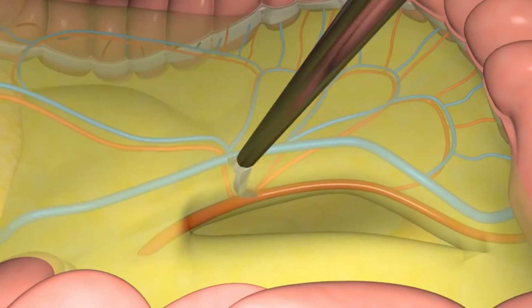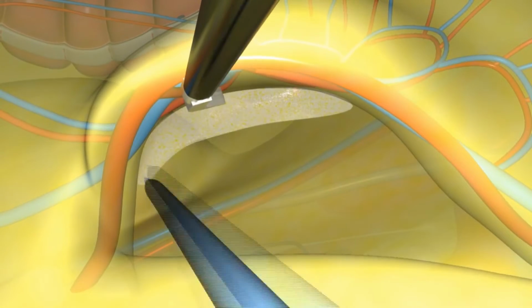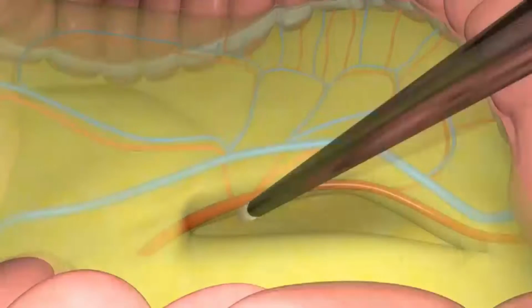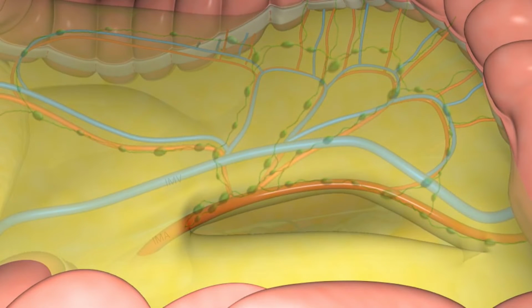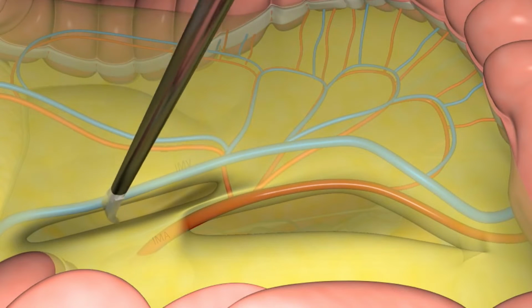In order to do that, an atraumatic bowel clamp is placed on the sigmoid mesentery at the level of the sacral promontory. This area is stretched, lifting the inferior mesenteric vessels away from the retroperitoneum. The dissection at the origin of the inferior mesenteric artery involves a risk of injury to the autonomic nerves situated around the inferior mesenteric artery.